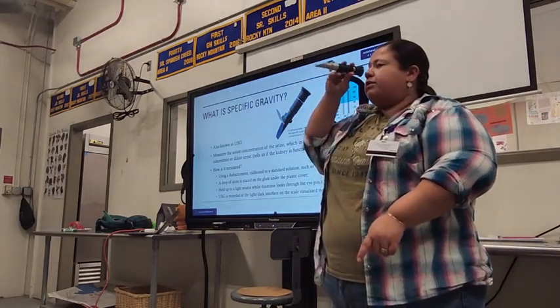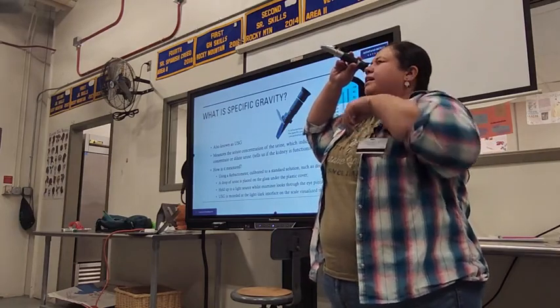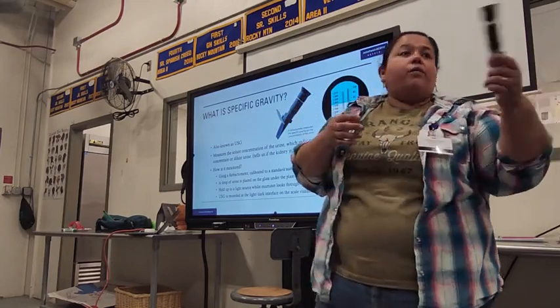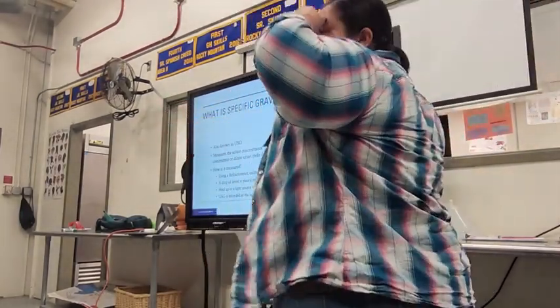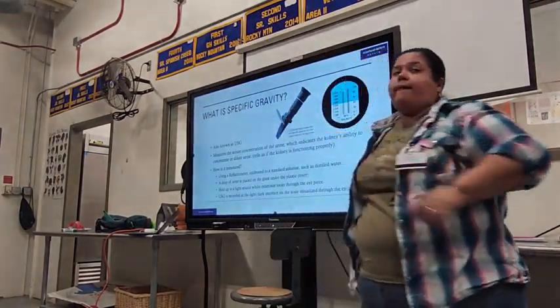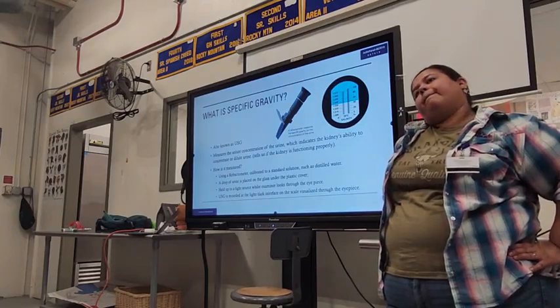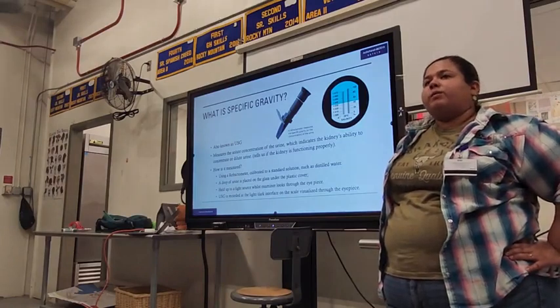And all you're going to do is look up, and you'll see the scale in there. So I don't know if you've looked through it. Okay, if you want to pass it around. Why is it slanted? For the light. They use it for human use as well.